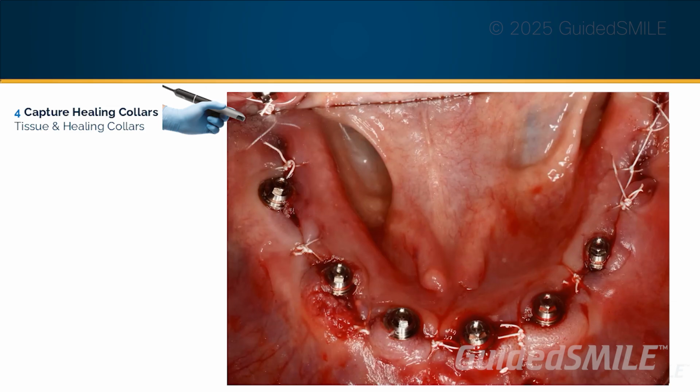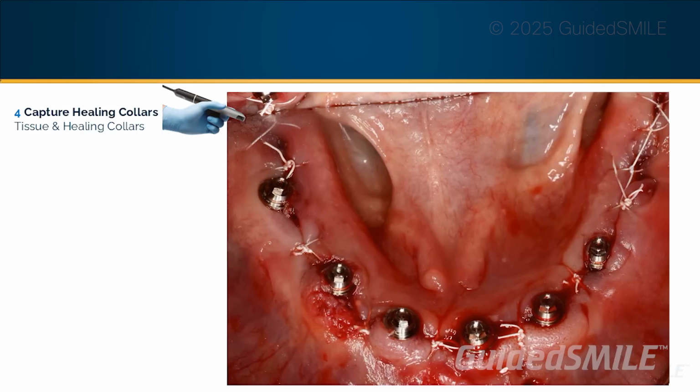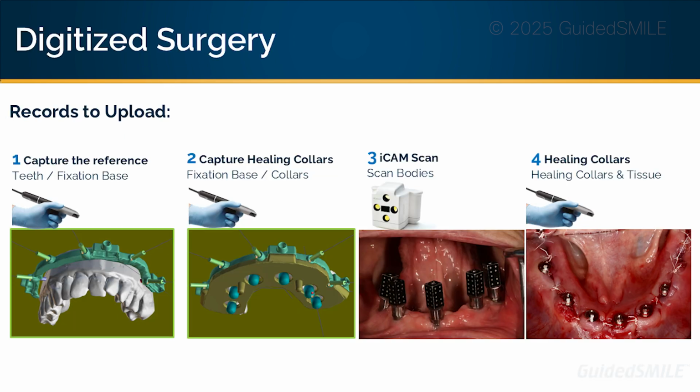Right. Then this is an optional scan, but then you come back and scan the tissue and the MUAs or the healing collars, either one. We like healing collars because the healing collars can match back to these healing collars. So just go across here pretty quickly and give us the tissue level. There's a summary of the scans. Send these off to us.